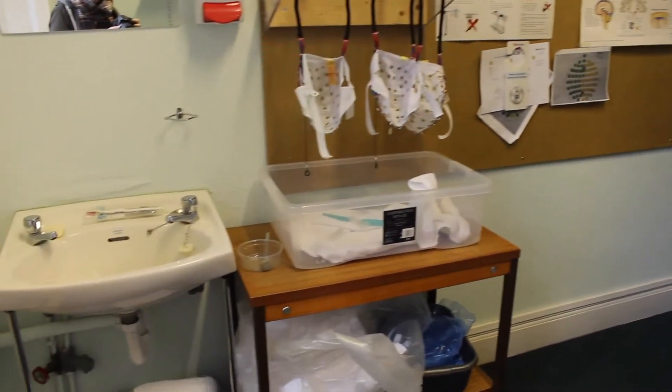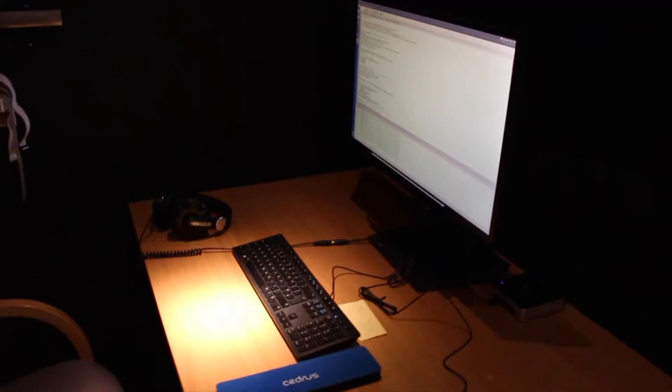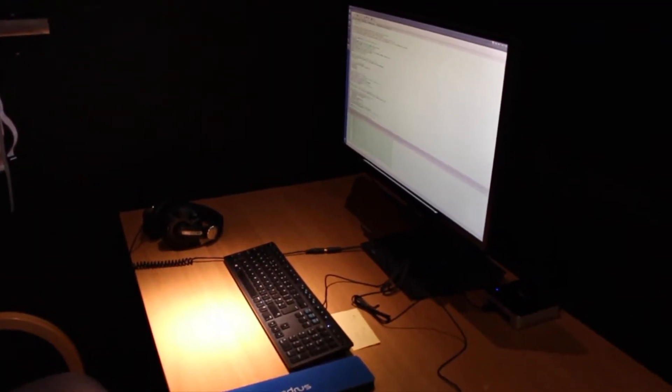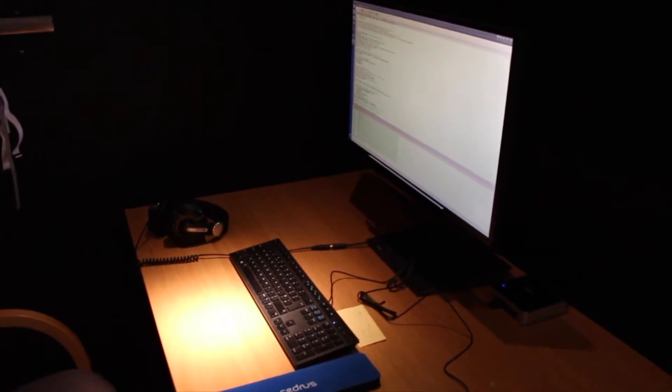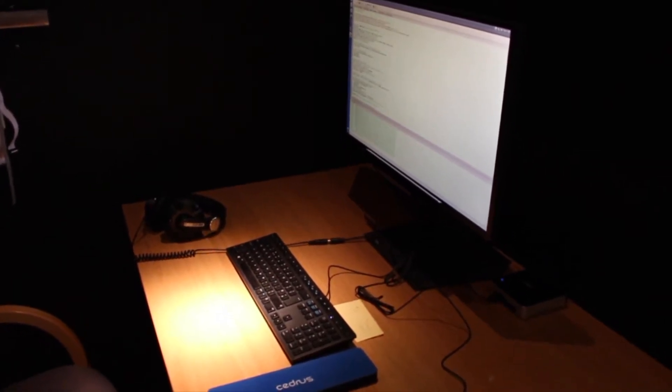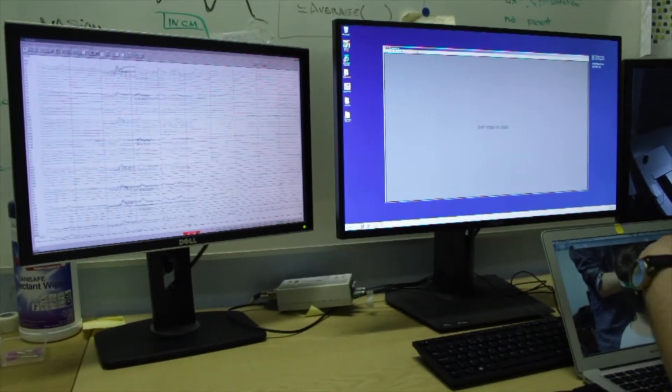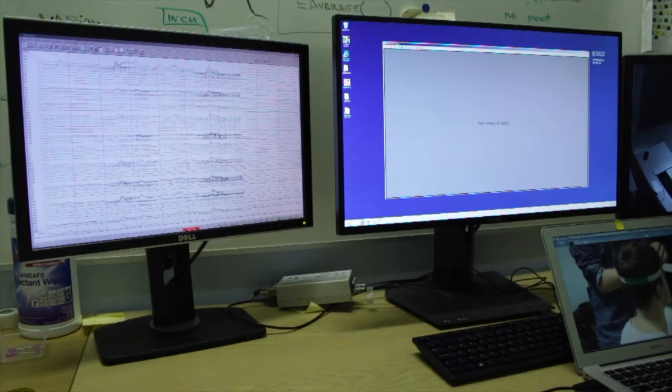There are currently two computers in use. The Stim PC, displayed on the monitor inside the booth, is used for stimulus presentation. As your participant does a task, triggers will be sent from this computer to the EEG PC. This is displayed on the monitors outside the booth and is used to record EEG data using the BrainVision software.